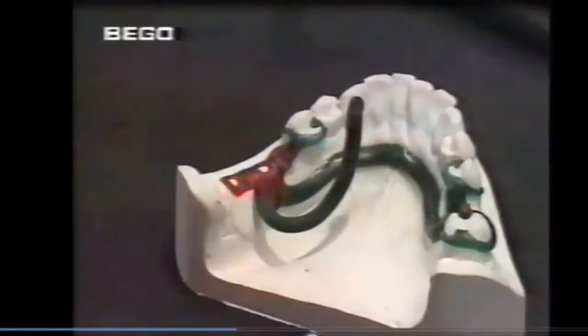On this work for a patient's lower arch, the 3.5 mm sprues are led to the wax-up from above and waxed on behind the wax finishing line and onto the bar. They should follow a uniform curvature to meet in the middle of the model, 10 mm above the highest point of the wax-up.